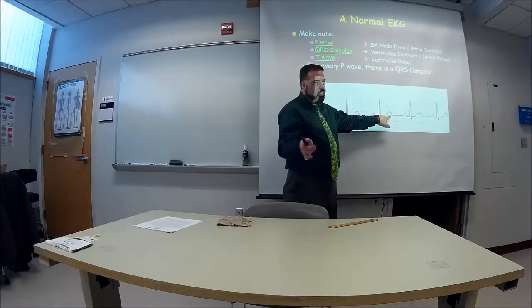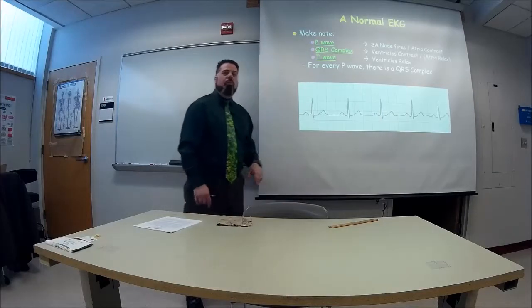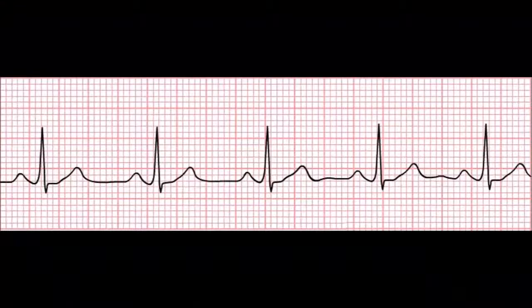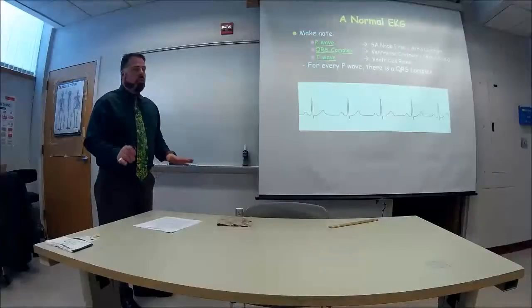Again, atria do relax, but it's hidden in this massive complex that happens in the QRS. So you should understand those.